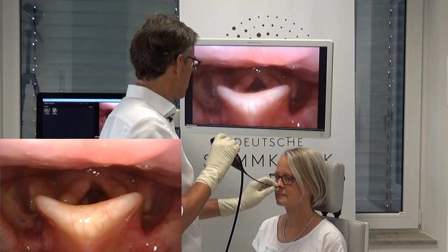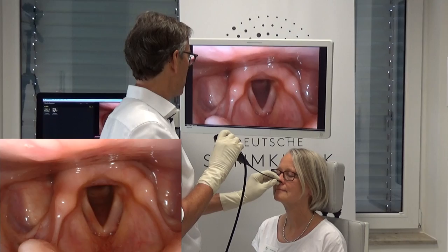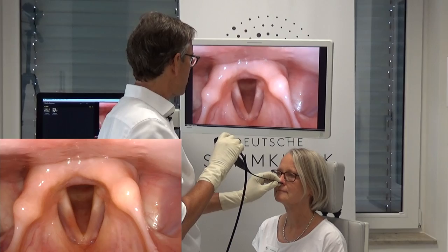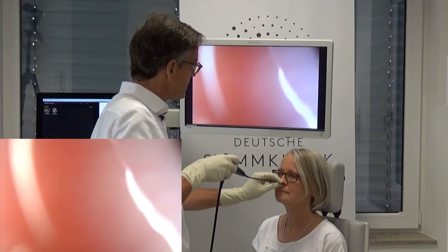First, I want to have an overview of how the larynx looks. I ask her to extend the neck a little bit so I can have a nice view. Usually I would go inside with a dipping maneuver, but now I want to rotate. Rotation is a combination of what you do with your hand while you rotate. Let's have a look at what happens — this is 180 degrees.